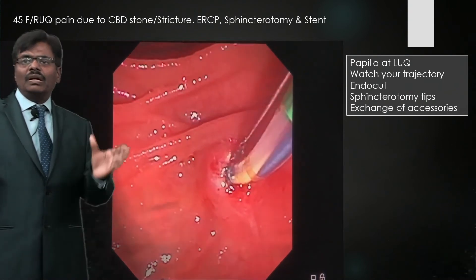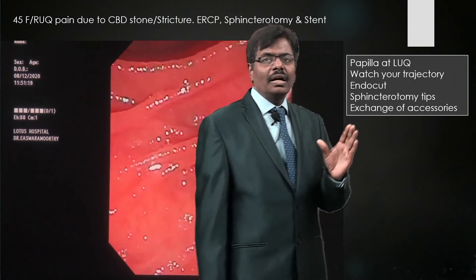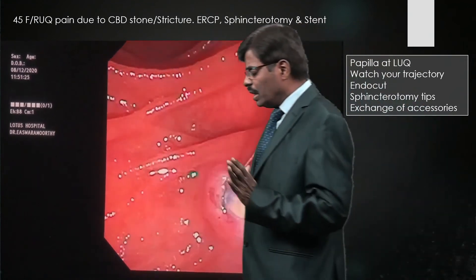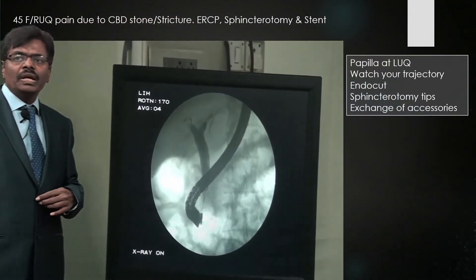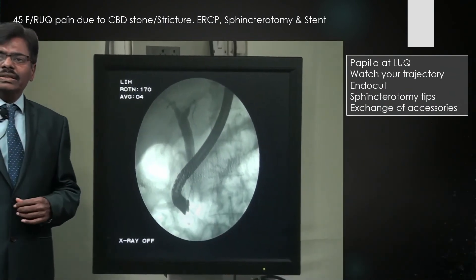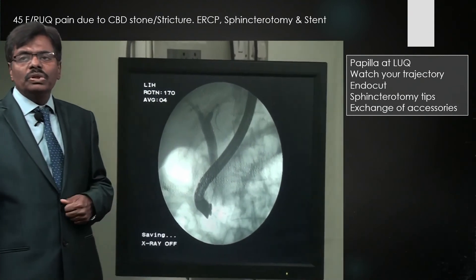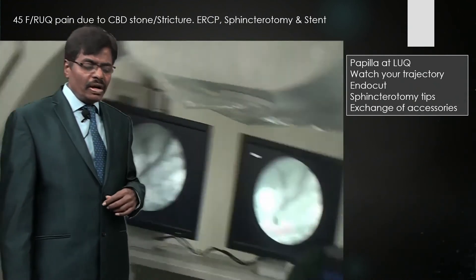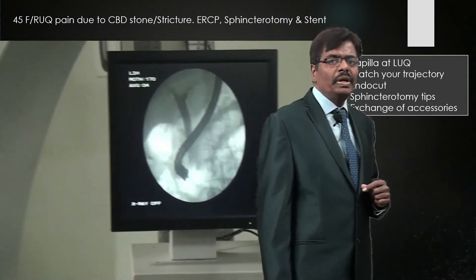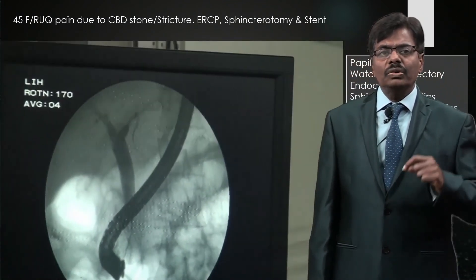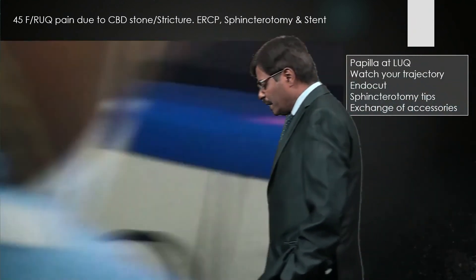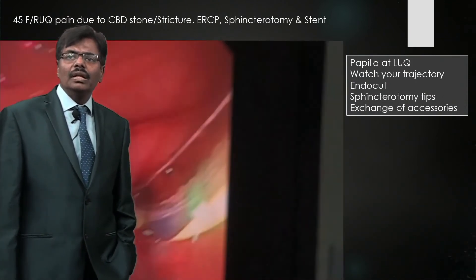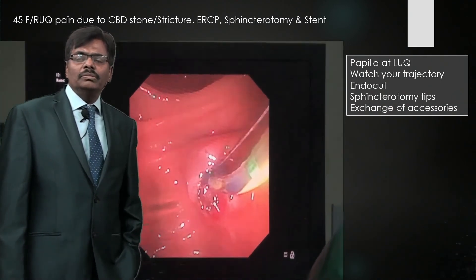The endocut must be done millimeter at a time — always check as you go. That way there is no zipper or uncontrolled cut — only a clean, controlled cut with hemostasis. Without endocut capability, I would not recommend performing ERCP safely. This is a fairly dilated duct — as dilated as the scope, so approximately 10.2 mm — suggesting a short stricture at the lower end. We need to determine whether it is a stricture or sludge, so we perform a balloon sweep.